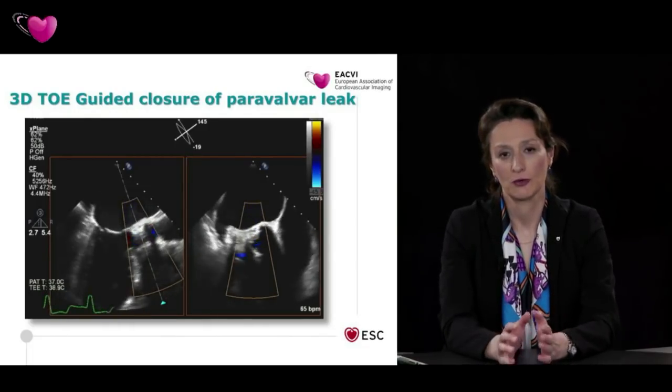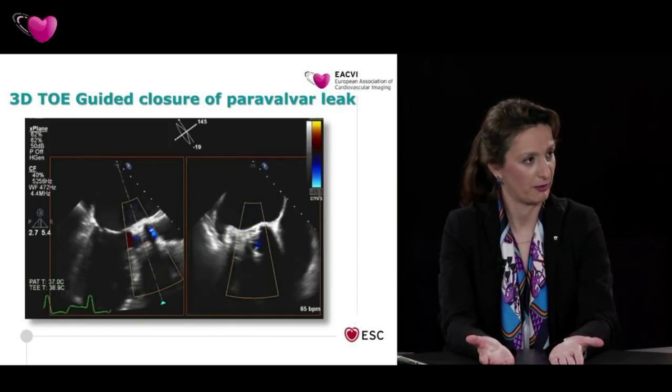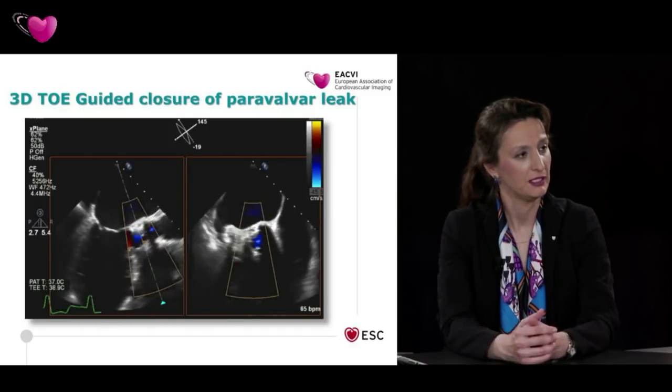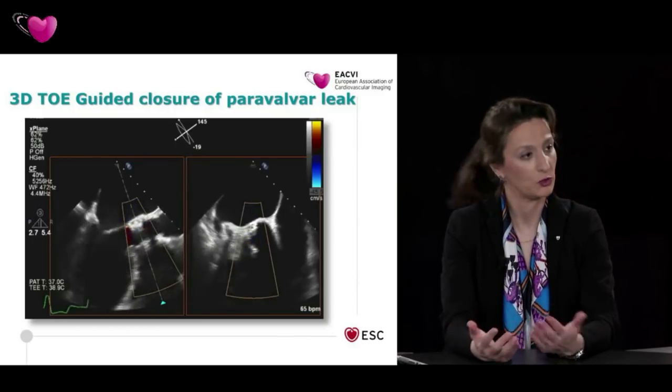So I have one question for you regarding what would be, for example, the quantification of paravalvular regurgitation. How do you do it? Because sometimes it's difficult. And is there any other imaging technique that can help? What do you think, Mark?